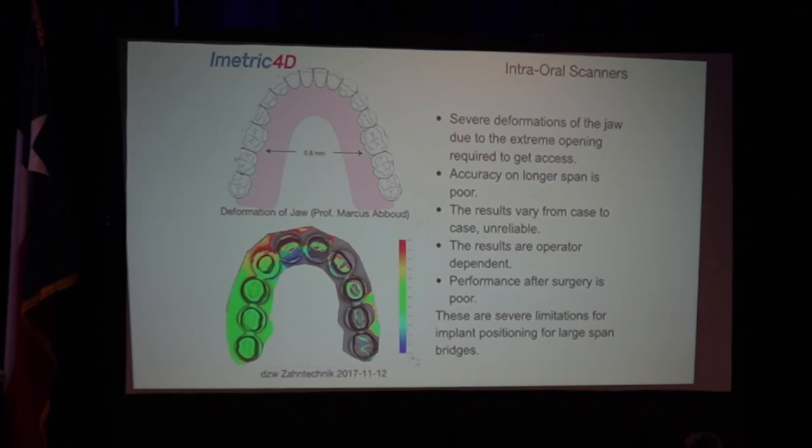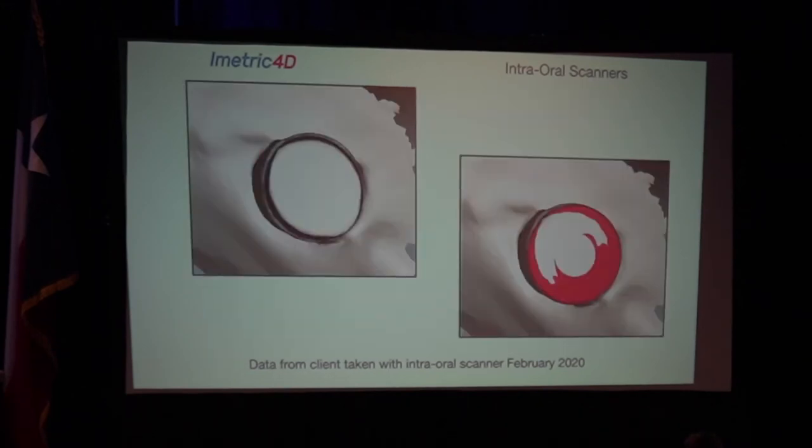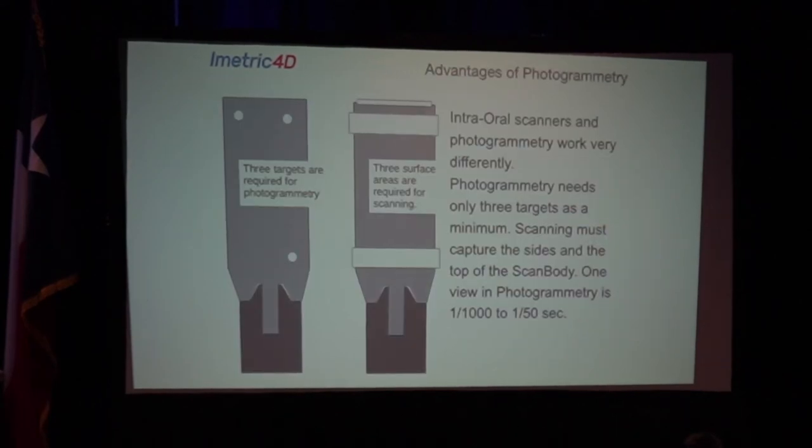Intraoral scanning is very user dependent, whereas with photogrammetry, the assistants can take the scan. Once it lights up green, it's verified. Okay, so this is showing that intraoral scanner. My scans wouldn't look like that, but the photogrammetry is taking the implants in space, and then you have to match that with the gum data, so you're still taking an intraoral scan. So just three targets are required for photogrammetry, whereas with the intraoral scanner, you're gonna have to go at least 180 degrees.